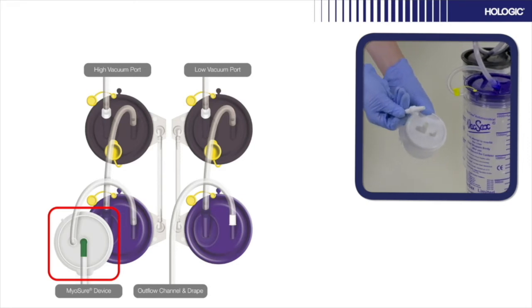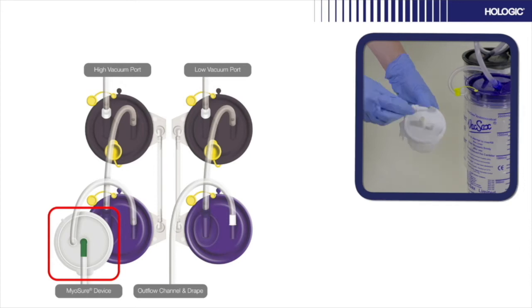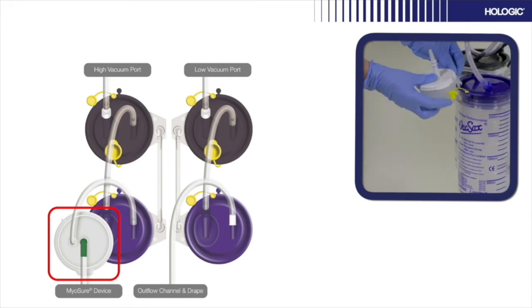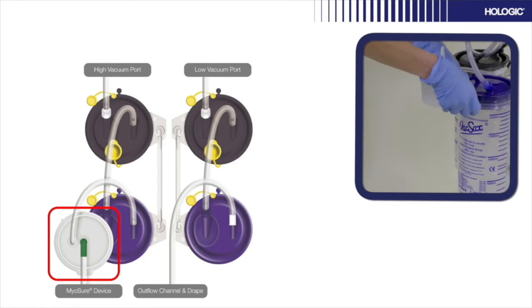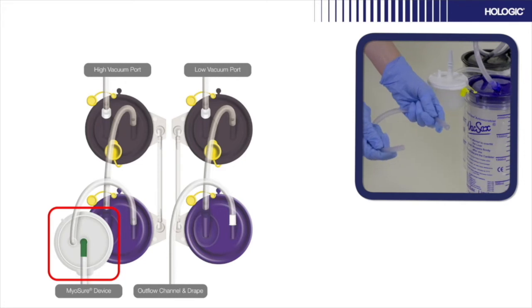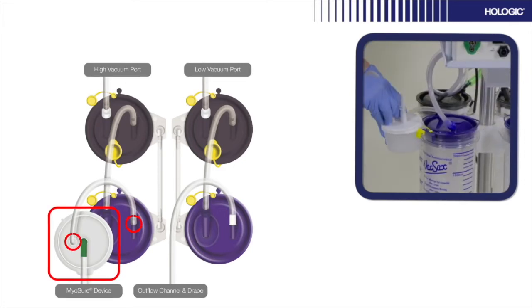If you have one available, insert the white connector into the tissue trap outlet. This will enable a secure fit for the MyoSure device. One end of the white connector will fit more easily into the tissue trap as shown. Clip the tissue trap onto the front left suction liner outer rim and connect the tube to the tissue trap and the canister.